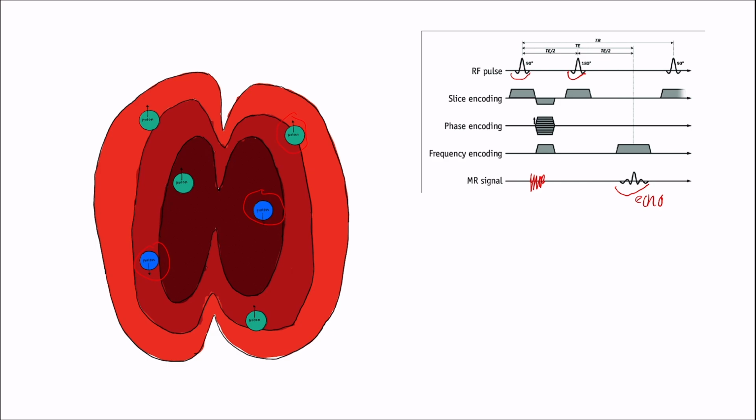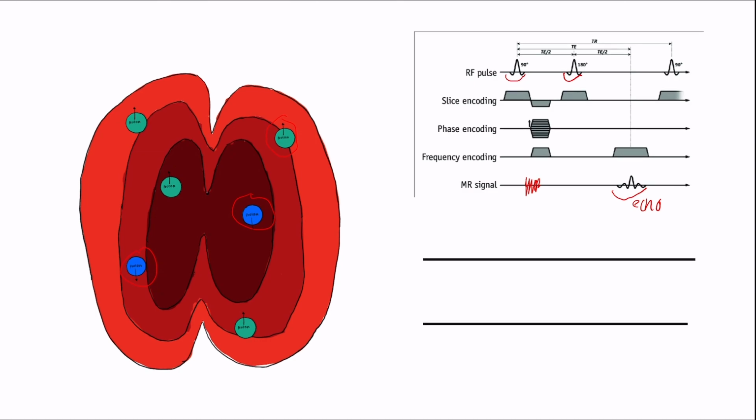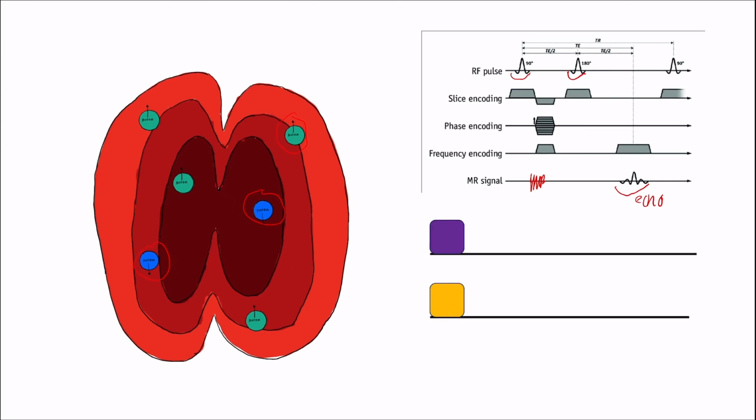Okay, so a kind of analogy that's oftentimes used with MRI to understand the 90 degree and 180 degree pulse to create uniformity: we have two lines with two cars, a purple car and a yellow car. They start a street race, for example, at the start line. We give them X amount of time, and in that time, the purple car has gone further than the yellow car has. But if at this exact moment we let them turn around and go back to the start line, theoretically, these cars would reach the start line at exactly the same moment. And this is kind of what happens with the protons, and therefore we have a uniformity within the protons, and that allows us to get a clear signal that we can turn into an MRI image.